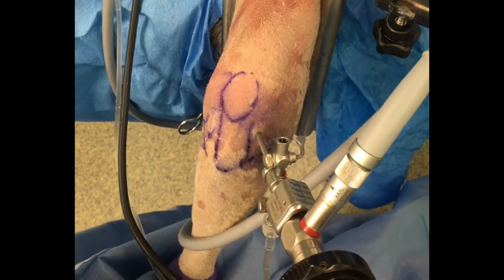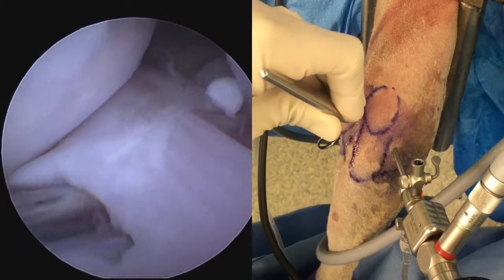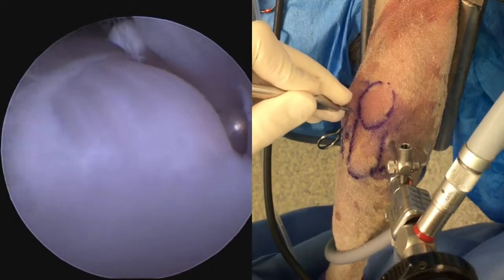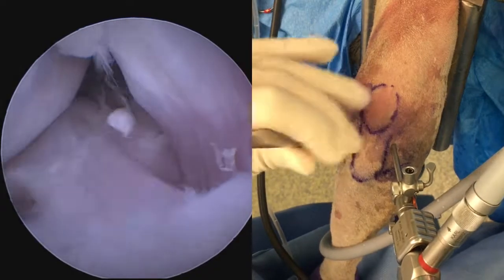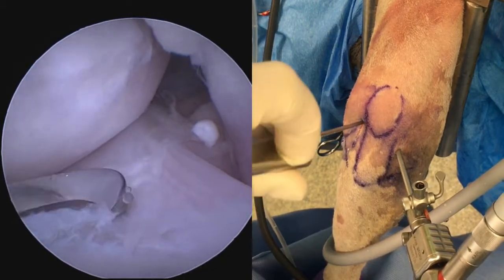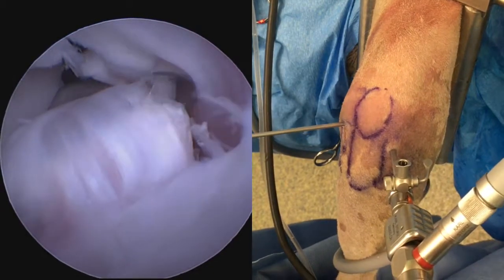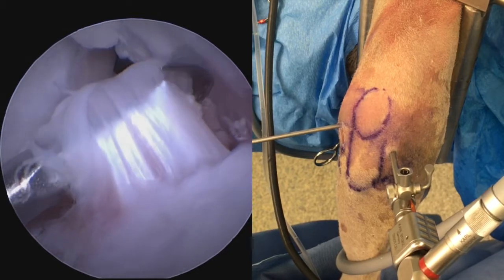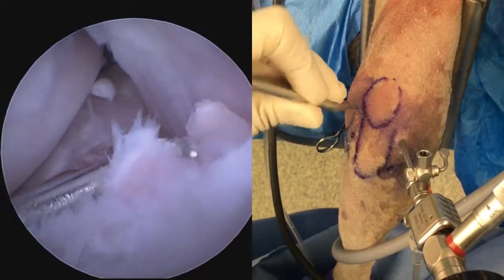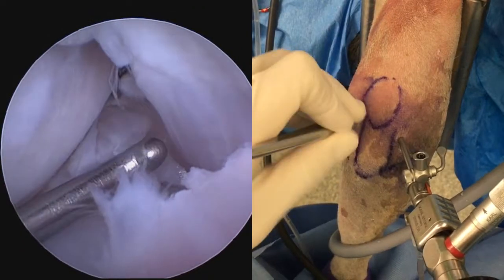For a caudal meniscotibial release, the scope is looking at the axial portion of the medial compartment with the light post in the up position, so we're looking down onto the meniscotibial ligament. A probe is placed under the meniscotibial ligament to get a sense of its width and the trajectory of the cutting device. In this example, an arthroscopic hook knife is used — carefully placing it under the ligament, turning the handle so the tip is pointing up, and applying firm but controlled traction. The meniscal release site is carefully probed to ensure a complete release, which is confirmed by caudal displacement of the caudal horn of the medial meniscus.